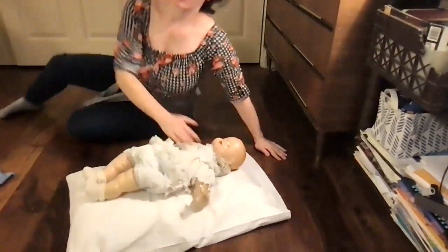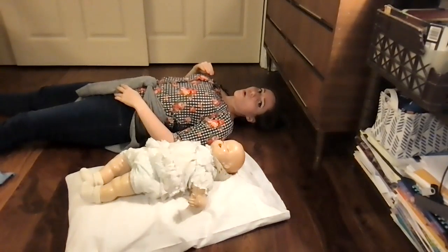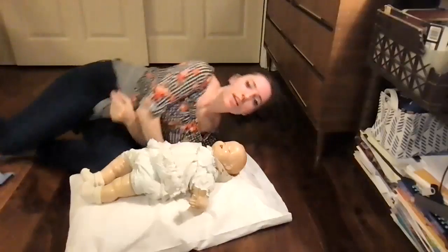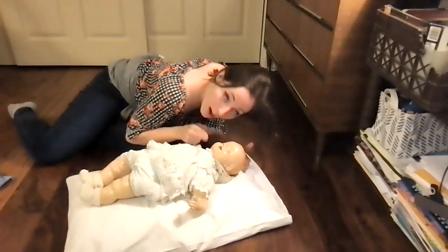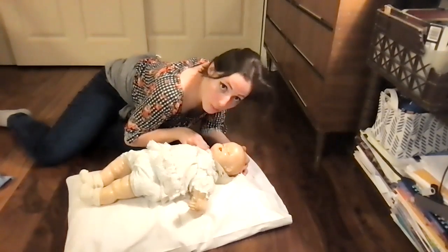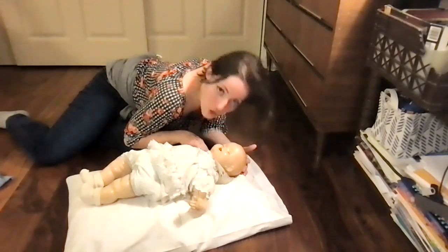So for instance, if I'm unconscious, you can see my chest going up and down. That's what you're hoping to see, some chest movement. But with the person you're looking at, if they're unconscious and having cardiac arrest, they're likely not breathing. So you're going to feel for a pulse and look down their chest for 10 seconds, verbalize that, and look for chest rise and fall.